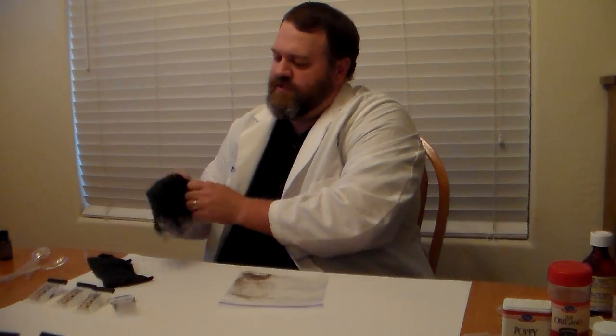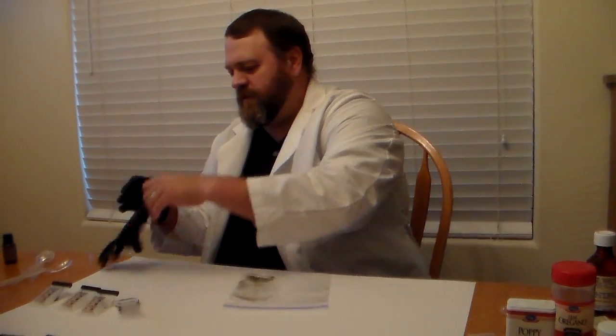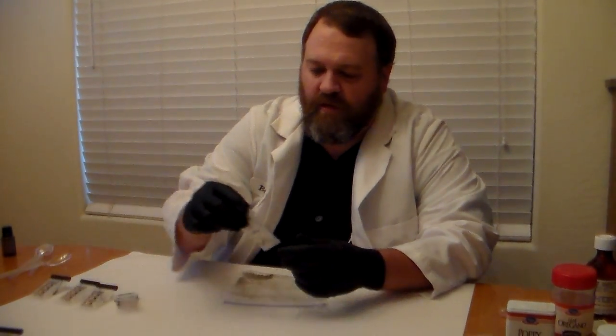I have some latex gloves here that I picked up at the dollar store, or you can buy them at a home improvement store or even at Walmart. The first test we're going to do is the Duquenois-Levine test, which again is a test for marijuana. If you look at the Duquenois-Levine packet, you'll notice that there are three vials in there, because the test requires the mixture of three different chemicals.